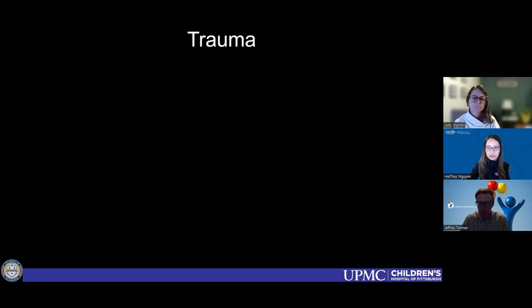But Judy, you briefly mentioned that sometimes you'll follow it if the lesion's better seen post-contrast. What if on follow-up, because it was already hard to see on grayscale, you don't see it, despite really scanning and trying to look for it? Do you still give contrast in that setting if you can't really truly target anything? You mean like on a follow-up grayscale? Yeah, follow-up grayscale, or even initial, like they'll be referred for a lesion and then you do your scout scan or whatever, and you don't see it. And you still just give contrast in hopes that you'll catch it?